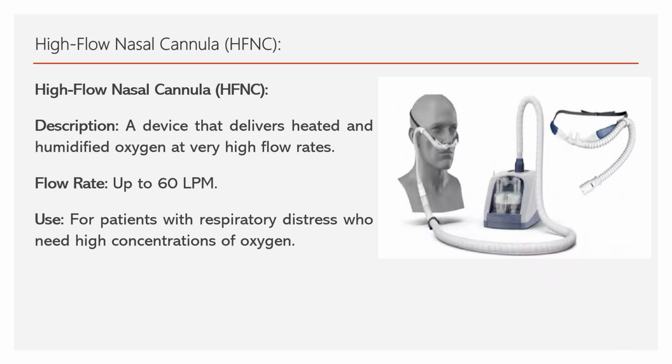High flow nasal cannula or HFNC. During the COVID season, this was very commonly used in almost all hospitals. Intubating a patient was very difficult during COVID time.